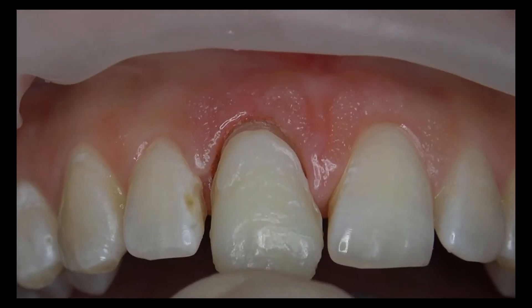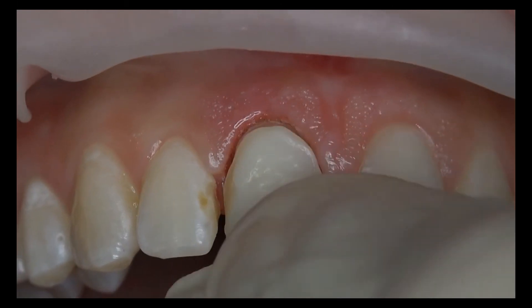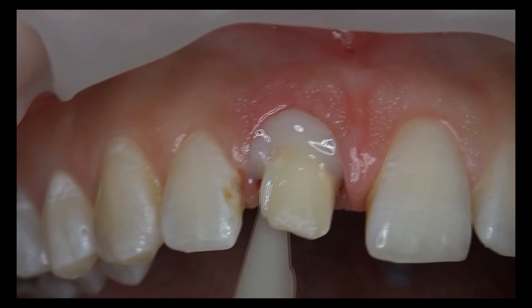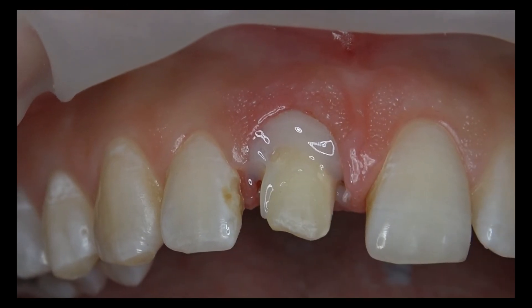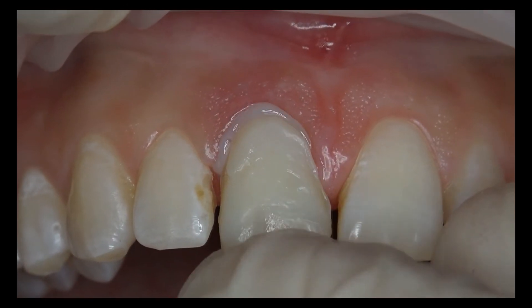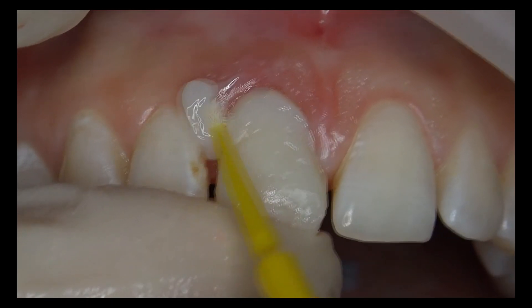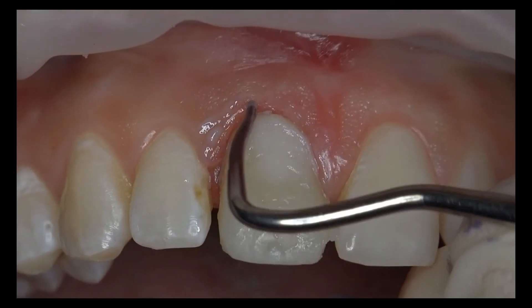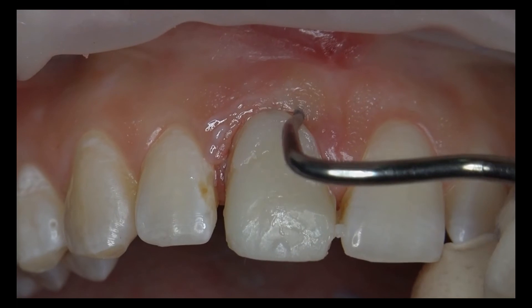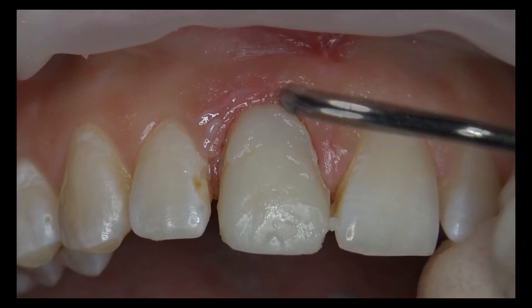We are slowly finishing our preparation with the corresponding sonic tip. After final surface finishing, the temporary acrylic crown prepared with the direct method on the existing crown is tried in. Its marginal adaptation is not appropriate as expected, so a high-strength intraoral acrylic like Strictor 3 is injected followed by temporary crown placement. The excess material is removed before setting and finishing is applied with a sonic instrument for optimal marginal adaptation. Some acrylic is added at the distal embrasure region to achieve symmetry and left slightly bulky.